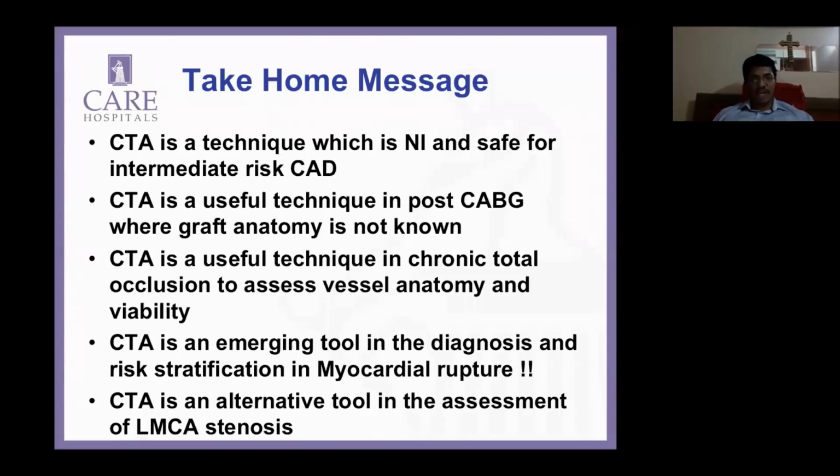Obviously, they charge you for it big time, and you get each vessel's FFR. Isn't that sort of amazing? And the three trials, you're all aware of them, had near concordance with the invasive FFR. And the best part with CT is you can do something called virtual stent planning. So you can have an FFR which is 0.6. You can interpose a stent, they have the software tools to do that, and then it becomes 0.9. So it means clearly that if you stent that particular portion, you're going to restore that vessel. So I think it's a beautiful planning tool.